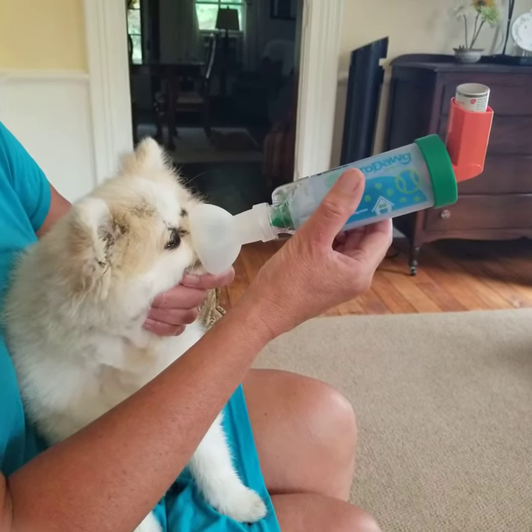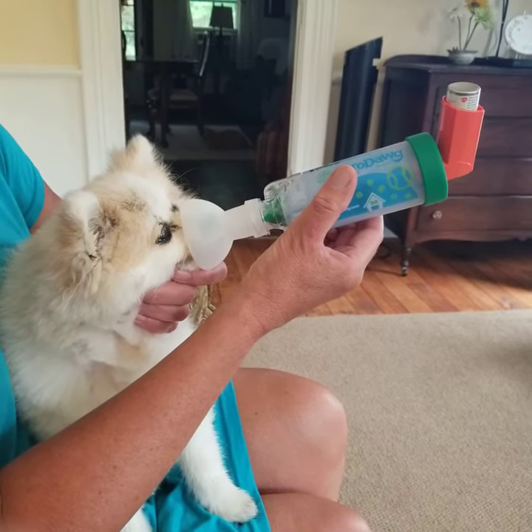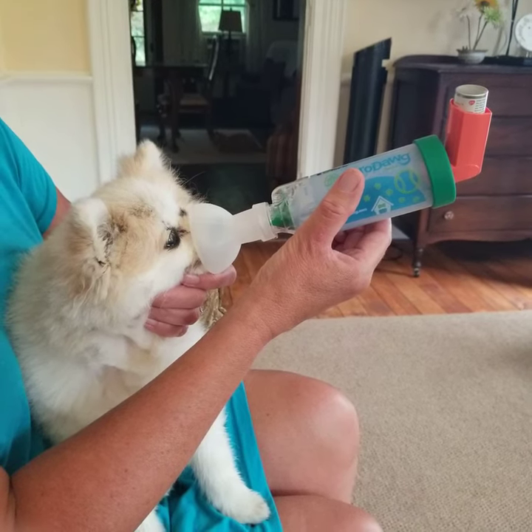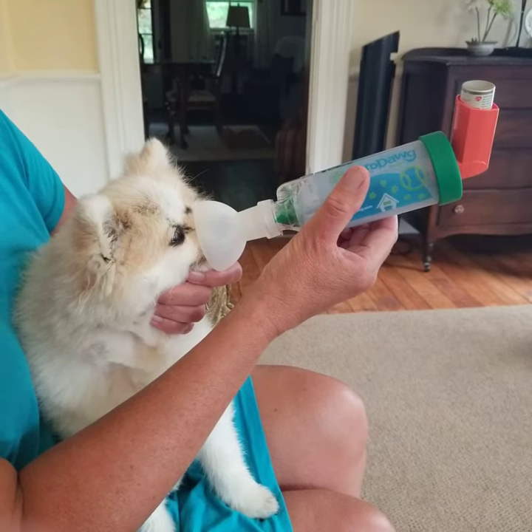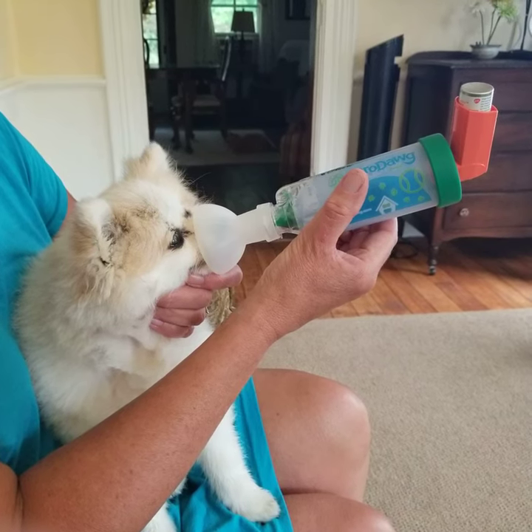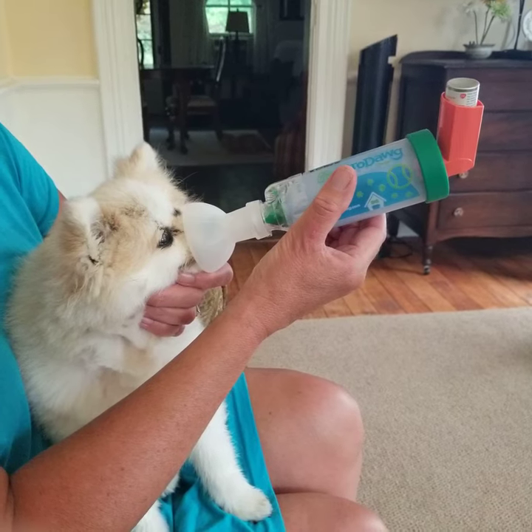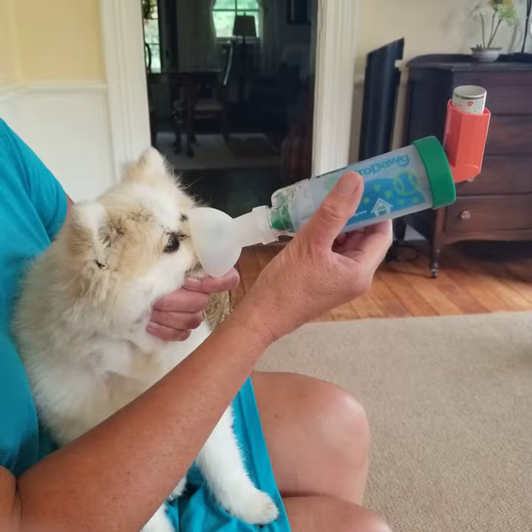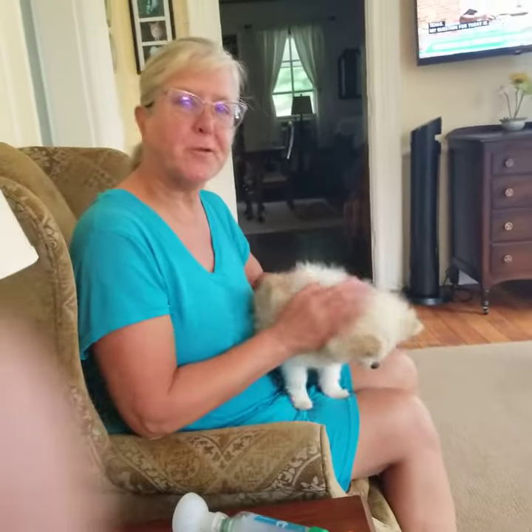That's about 10, but since she's behaving, I'll take a couple more. That's about 15, so she's doing good. And that's it — she did good. Then she gets her nummies afterward. Thanks.